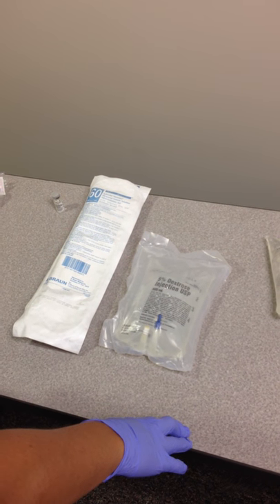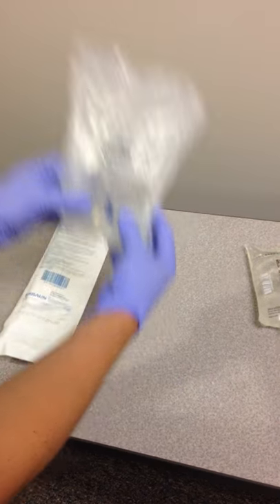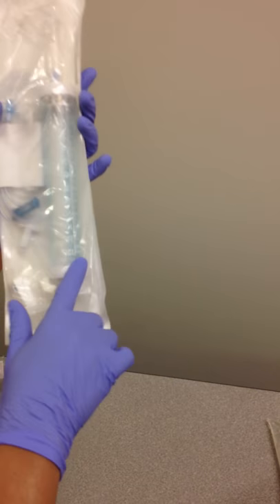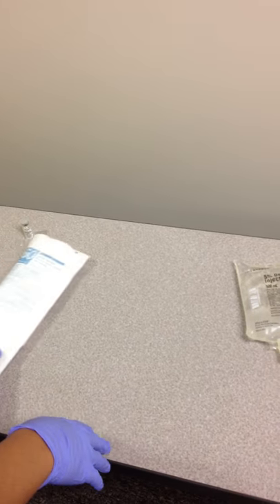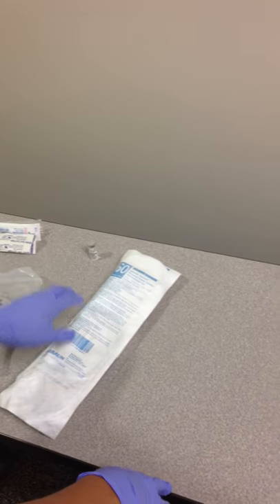Give amiodarone with a burette set. What we're going to need is a bag of D5W, a burette set, 60 drop burette set, and then we'll need the amiodarone and a syringe to give it.